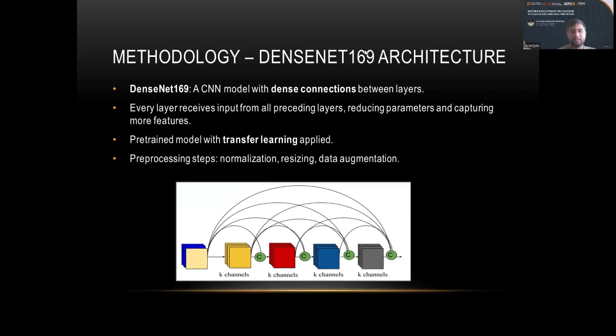To address these challenges, we turn to deep learning, specifically convolutional neural networks (CNNs), which offer a robust data-driven approach. Unlike traditional methods, CNNs do not require manually engineered features. Instead, they learn hierarchical representations directly from the data. This means the model automatically identifies key features relevant to detecting DR without needing explicit instructions from experts. Essentially, it shifts the paradigm from manually crafting rules to letting the model learn patterns from the data itself.